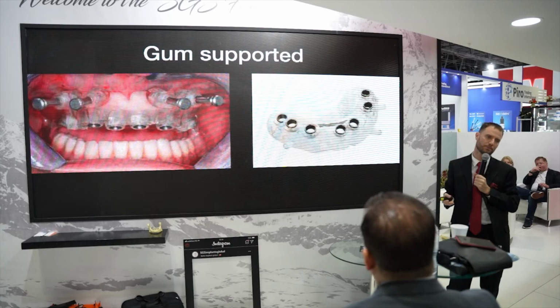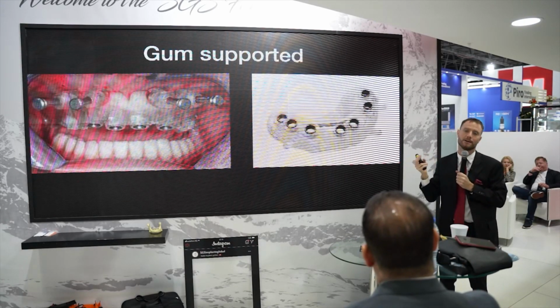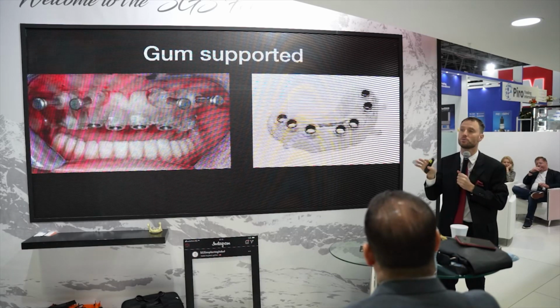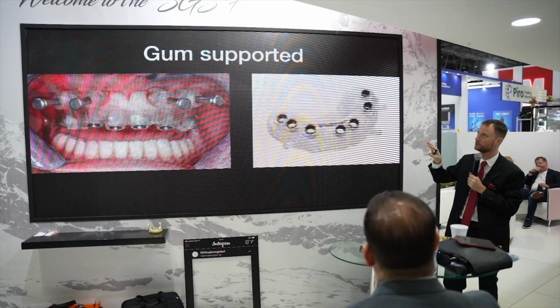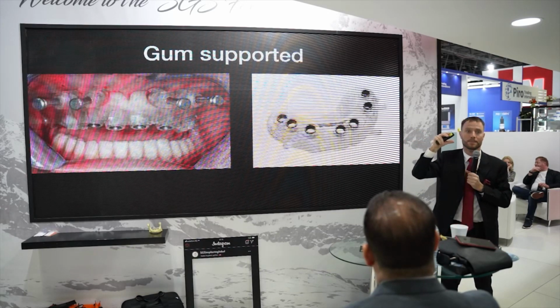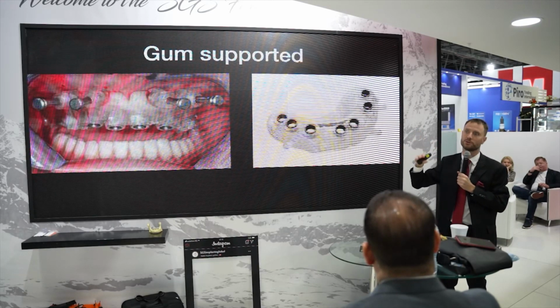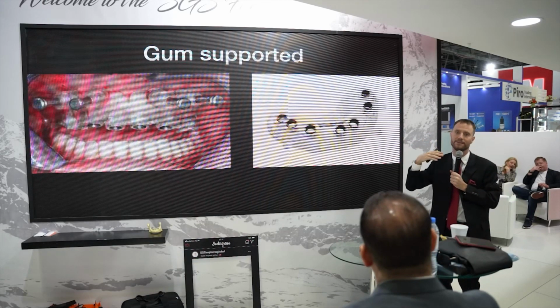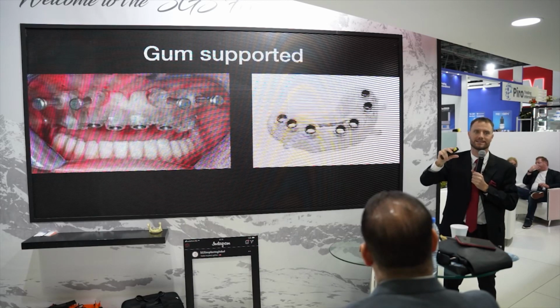And then we have the gum supported ones. Today what we know, it works, it's nice, but gum supported always will be a compromise. You have to expect much more deviation with any of the guides, any type and any way of drills, especially because with the soft tissue, you can't even do a scan. Usually you need to have an impression with all these drawbacks with the silicone and these dimensional changes, and also when you put on the guide, soft tissue has its resilience.